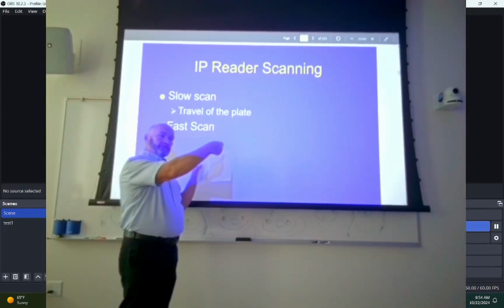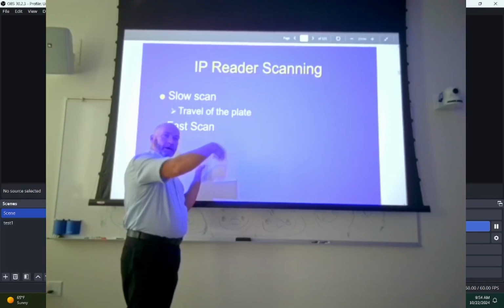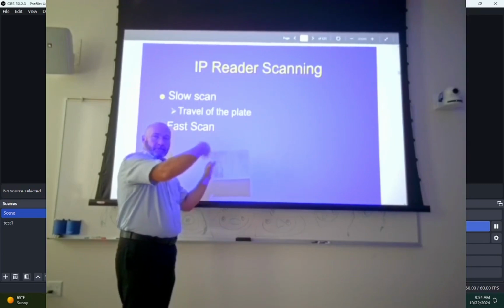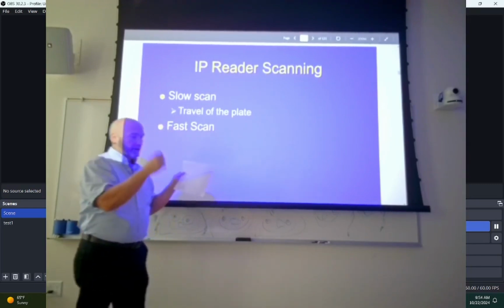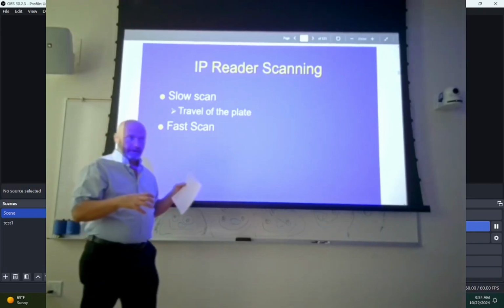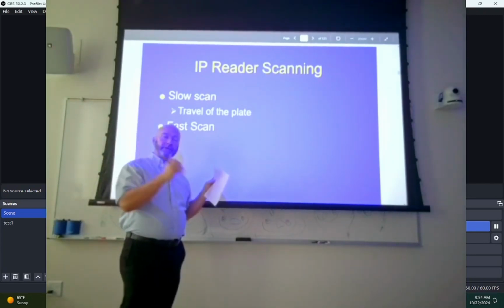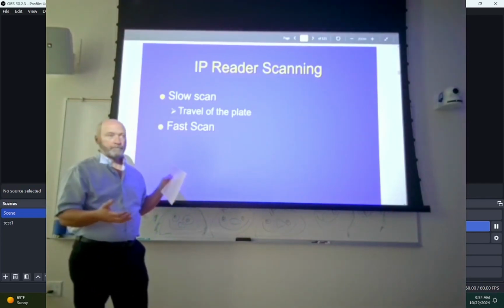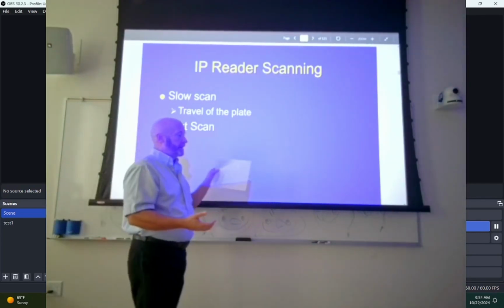So we've got a laser situated in one place, and it's just going up and down this thing at a really fast speed while the plate is going through at a really slow speed. The purpose of the laser is to release that stored energy of the metastability and return the phosphors to their most stable state. Okay, so release the energy.